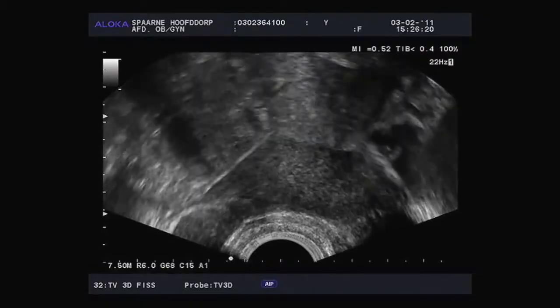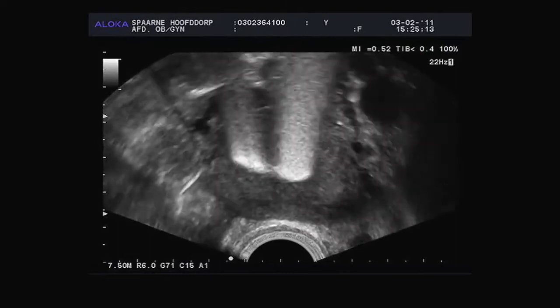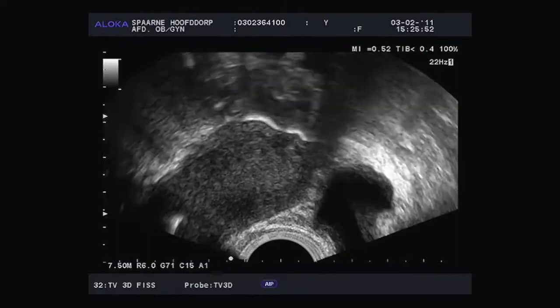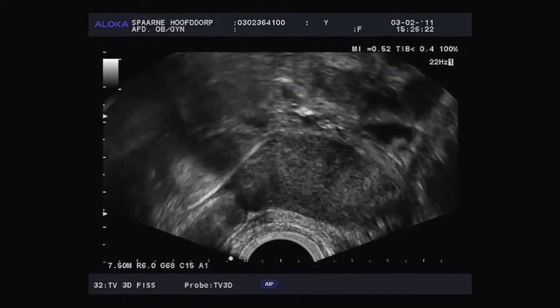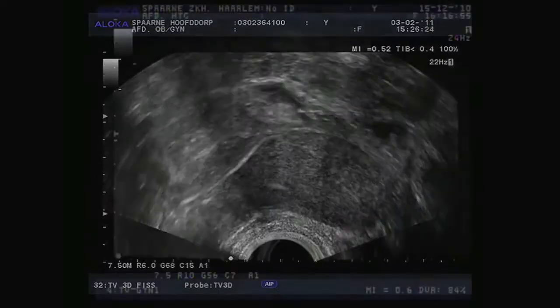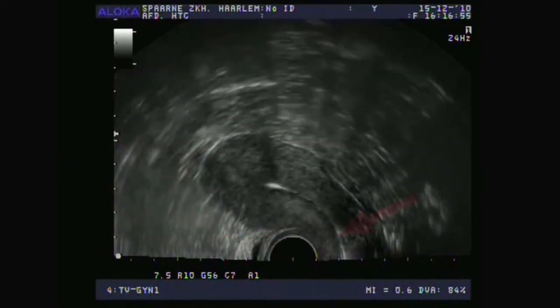Here are some ultrasound images. What do you see? Can you assess whether the fallopian tubes are open? Let's look at these images again more closely. This view is from the bottom upwards. This is the ultrasound transducer. This is the woman's uterus, and this is the abdominal wall. And this is the woman's back. This is where the tip of the ultrasound is.